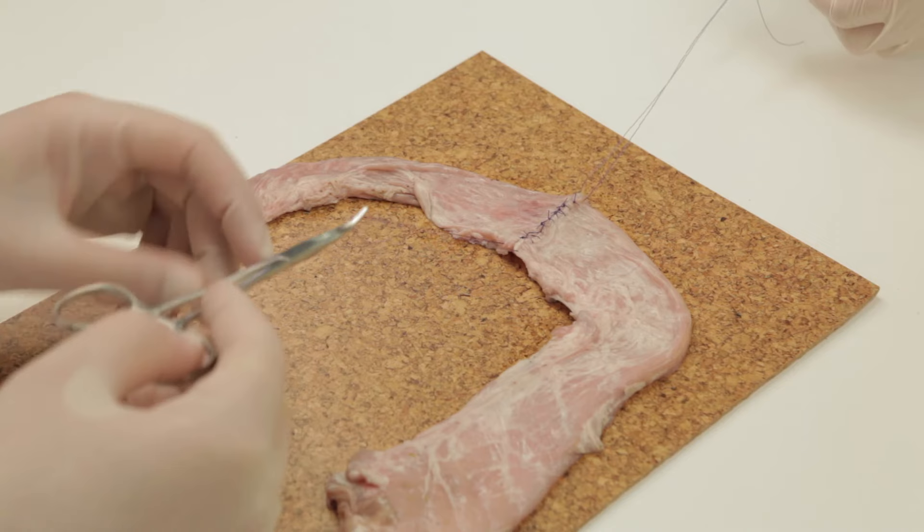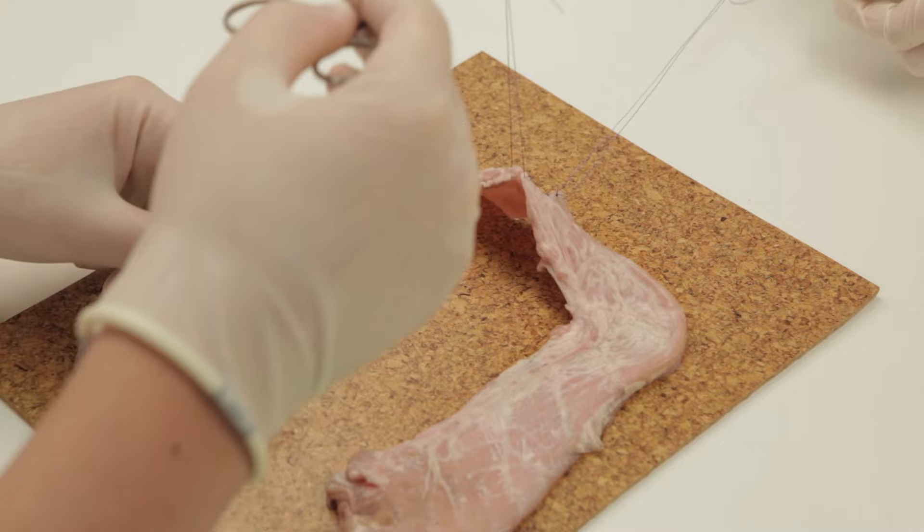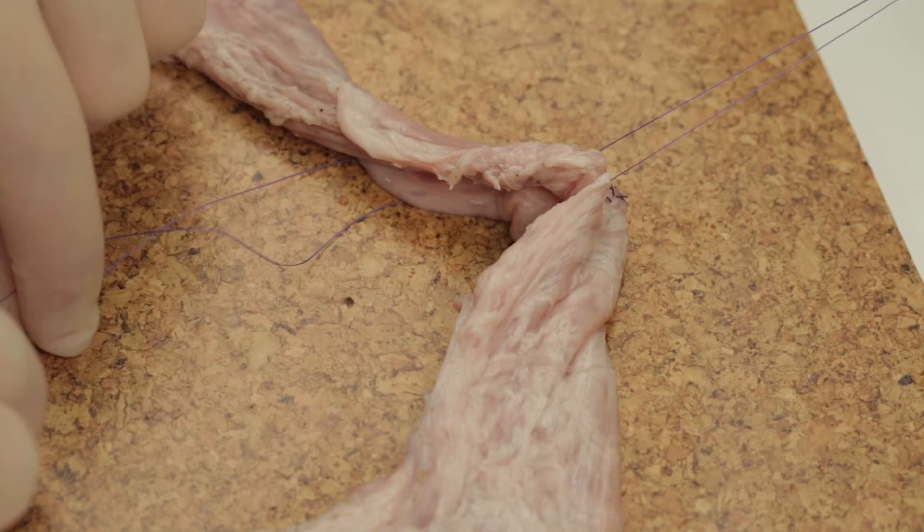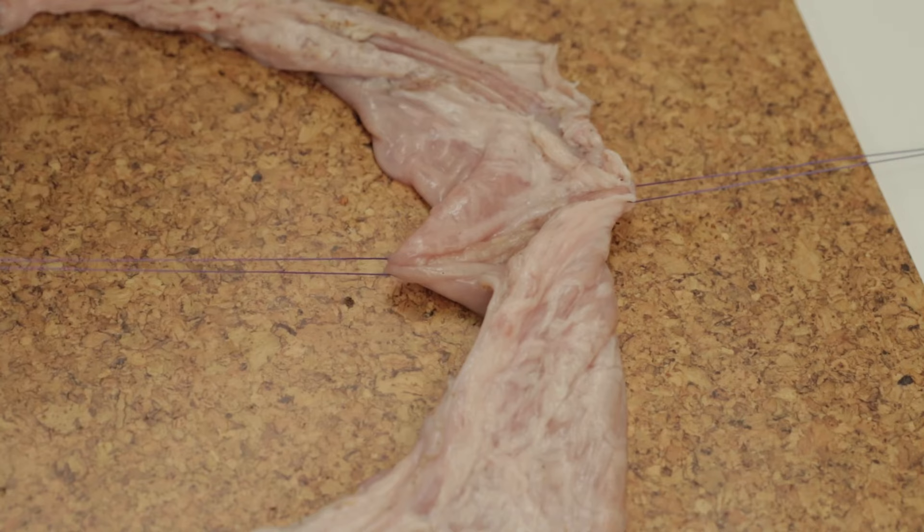Once one side of the bowel has been securely closed, with 5 throws in each suture, the bowel will need to be turned. To do this, pass one of the clips holding the stay suture under the bowel. If these are then pulled, the unsutured end of the bowel will show itself.